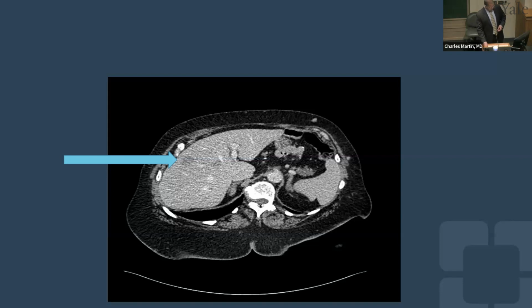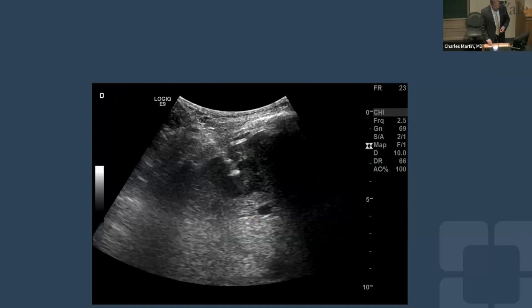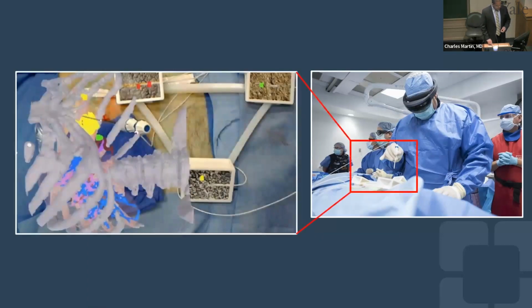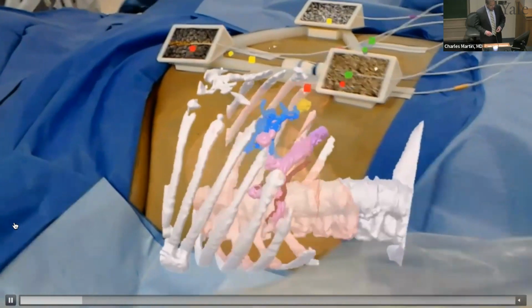I don't know if it's projecting well, but this was a really tough tumor to see. And truthfully, there was a lot of vasculature around it right there. So we were able to see it a little bit better under ultrasound, but there were still a whole bunch of vessels there. And we were able to effectively target it, ablate it, and our area was modeled right here. And this is just another video that shows a different patient.